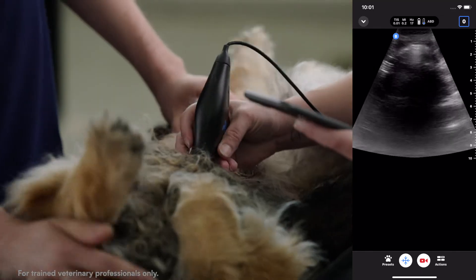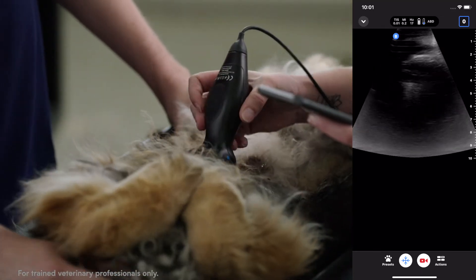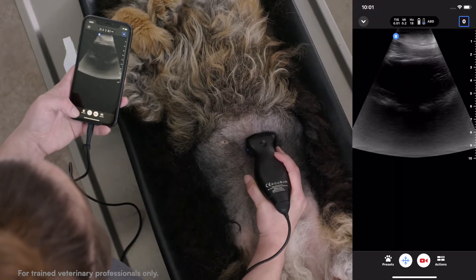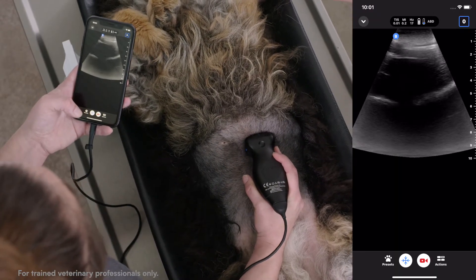To help get around this, you'll turn your probe into the transverse plane, putting your indicator towards the right side of the abdomen and fanning cranially to shoot up and under that stomach.